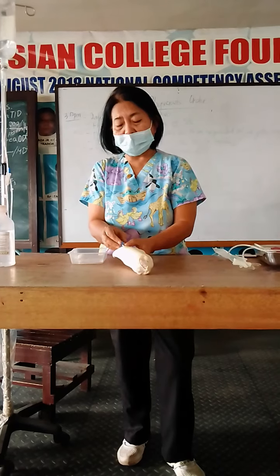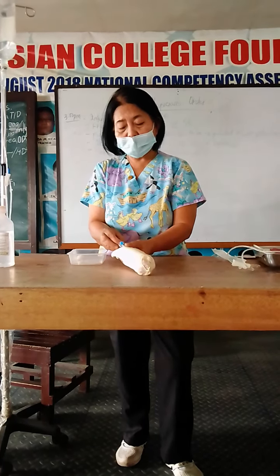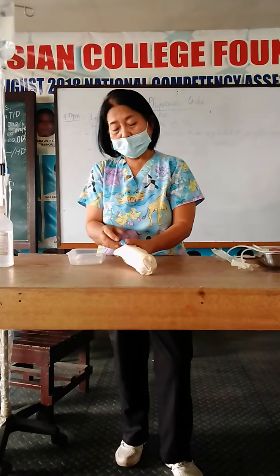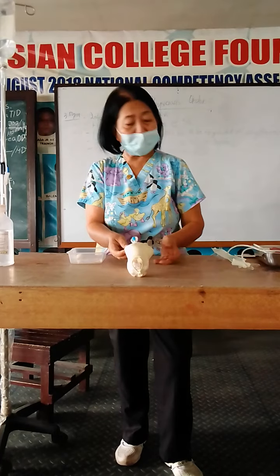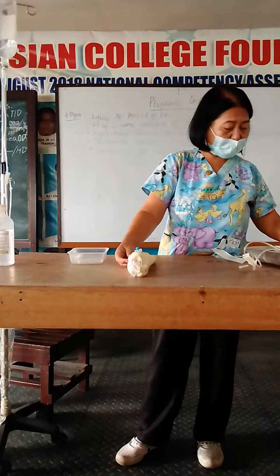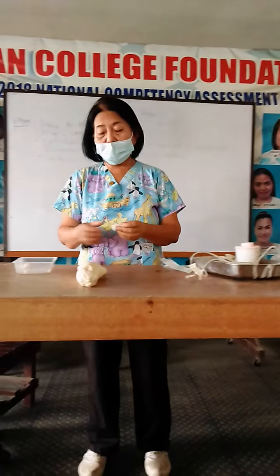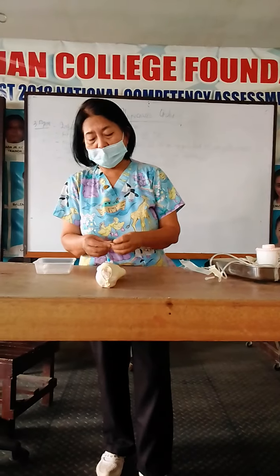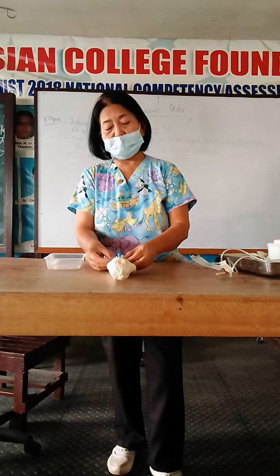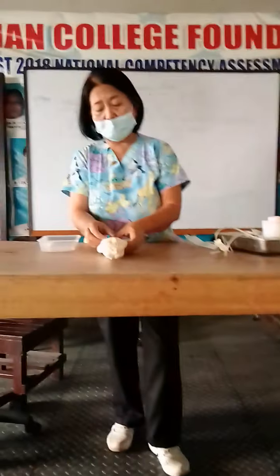And then when you're already there, you push the catheter inside, and then you pull the metal. In order to avoid mess from blood, there should be a gauze under. You put a gauze there, so that if there is blood spillage, it will not render the patient's skin dirty or bloody.